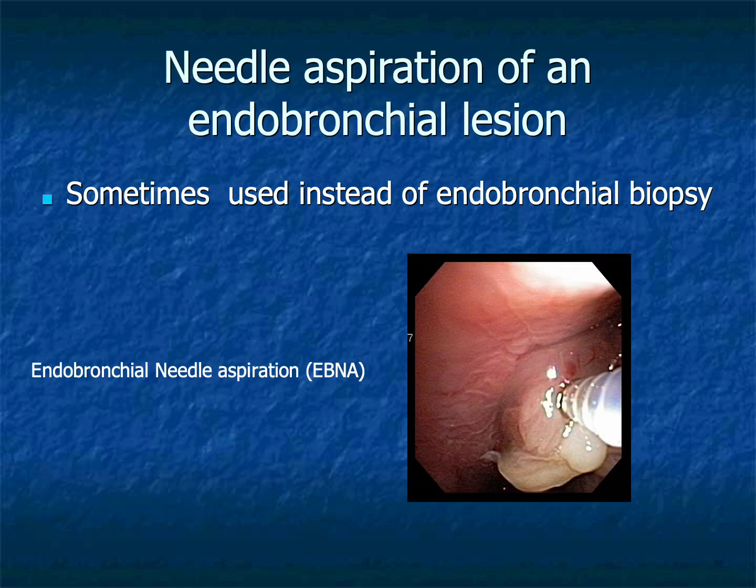Needle aspiration is not limited to mediastinal lymph nodes. When endobronchial needle aspiration is used to sample visible airway lesions, forceps biopsy can be avoided, especially when it carries substantial risk of bleeding or when the abnormality lies primarily beneath an intact mucosal surface. In selected patients, needle aspiration provides excellent diagnostic material while minimizing trauma to the airway.